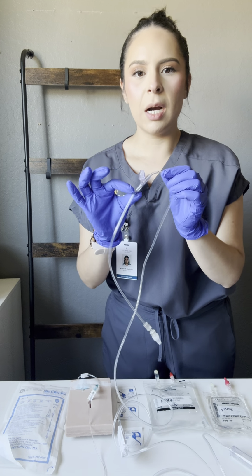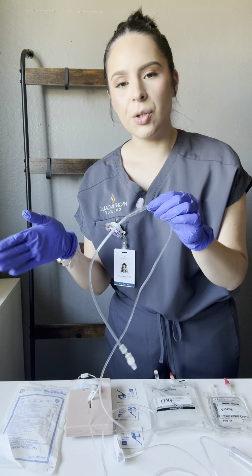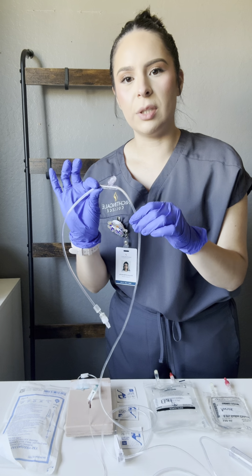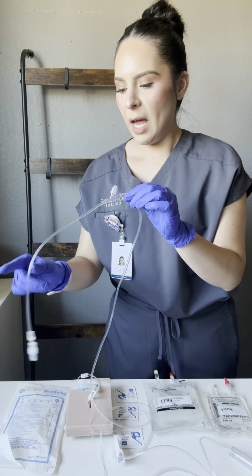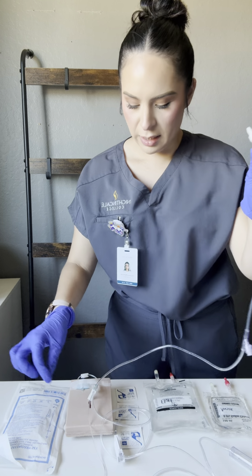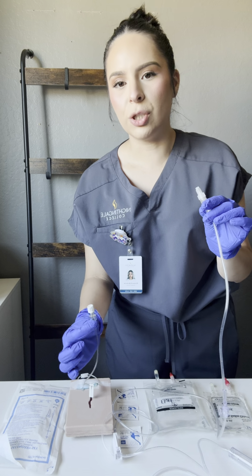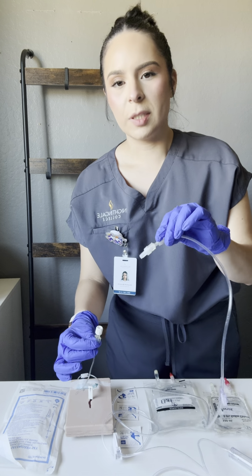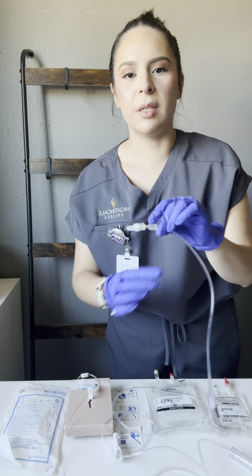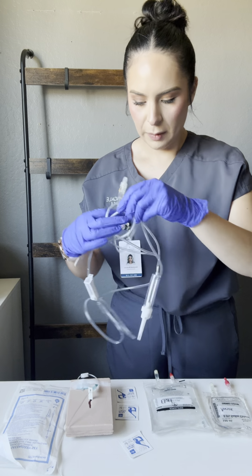This port here helps us administer additional fluids or medications using only a single IV line. And then this end here is called the adapter end. The adapter end connects to the end of our patient's luer lock, which helps deliver the fluids or medications into the patient's IV.